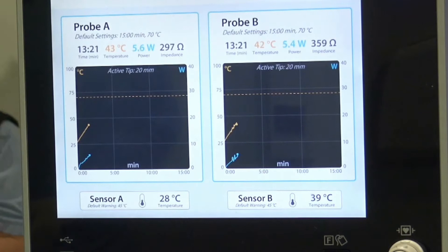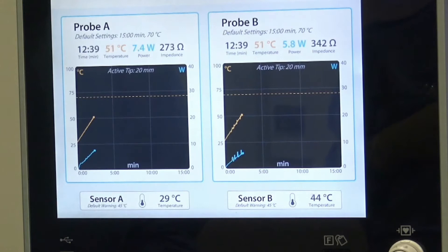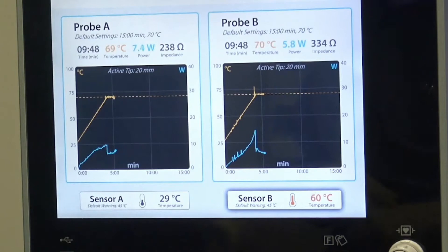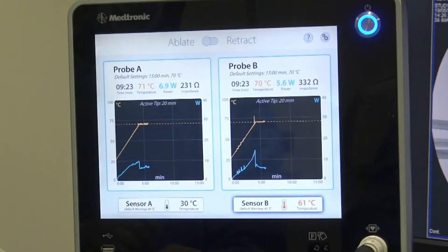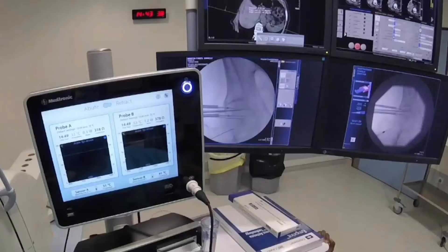During the whole time, careful attention is paid to both thermosensors. Because of the nearness of the RFA probes, the cartilage is more exposed. The intact cortex of the posterior acetabulum is insulating the sciatic nerve from the ablation zone — cortex insulation is a typical feature of bipolar radiofrequency ablation. When the temperature is reaching 60 degrees close to the cartilage, ablation is stopped to avoid any thermal injury to the joint. We did not complete the scheduled 15-minute ablation cycle; I will wait for the temperature near the cartilage to decrease and then start a second cycle.